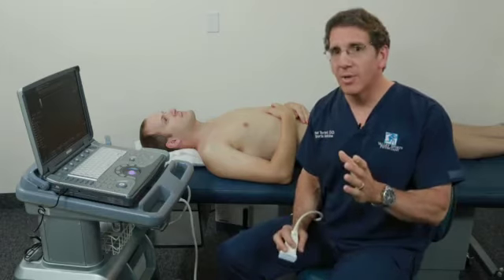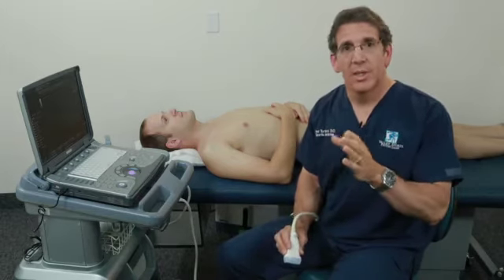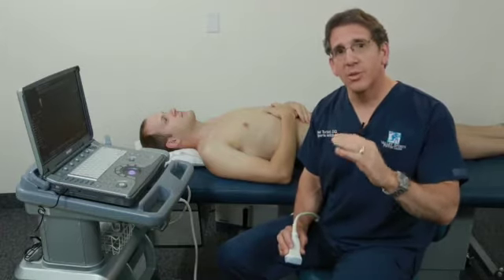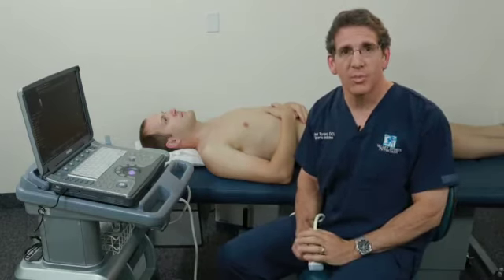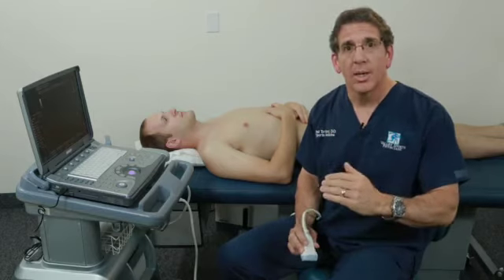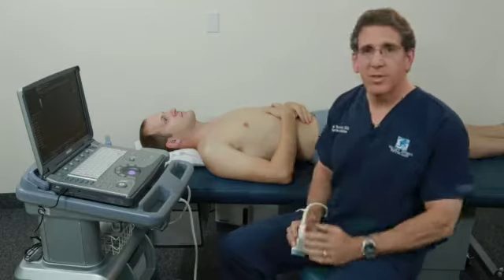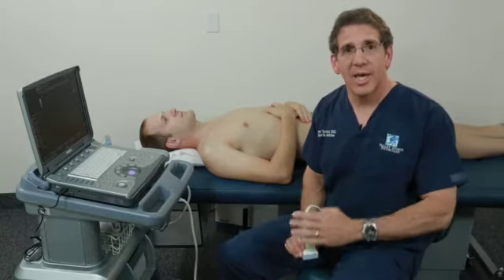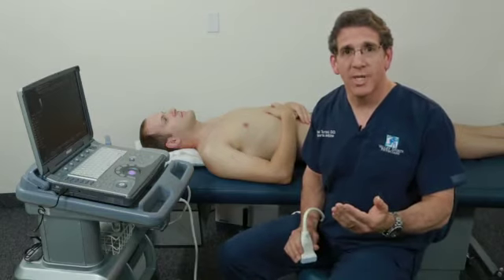Keep in mind, however, that in addition, there's a relationship between scanning frequency, depth, and resolution. Your greatest resolutions are going to be at the highest frequencies, but that's also going to be at the most shallow penetrations. Your lower resolutions will be deeper, and that's also going to be at your greatest depths. So again, going back to our lateral elbow, relatively superficial structure, we can scan at a higher frequency to get better resolution, but we don't need a lot of depth.